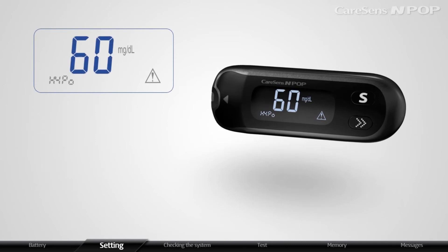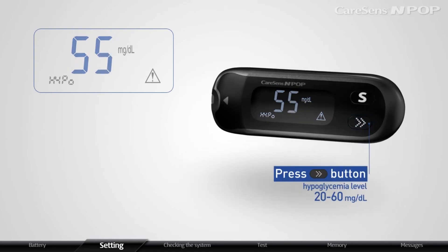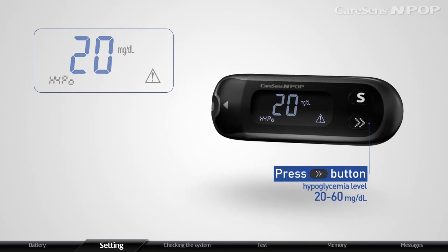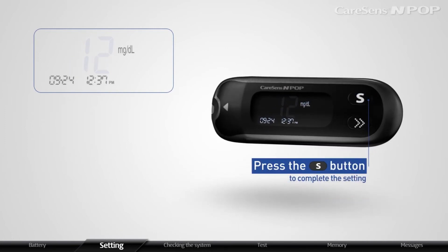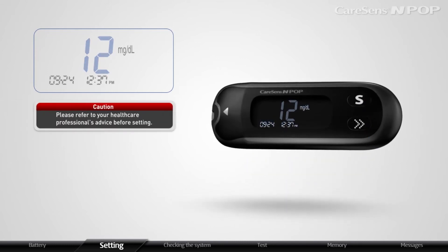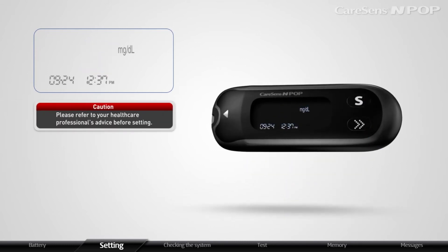Press the arrow button to set an appropriate hypoglycemia level within the range of 20 to 60 mg per deciliter. Press the S button to complete the setting. Please refer to your healthcare professional's advice before setting the hypoglycemia level.